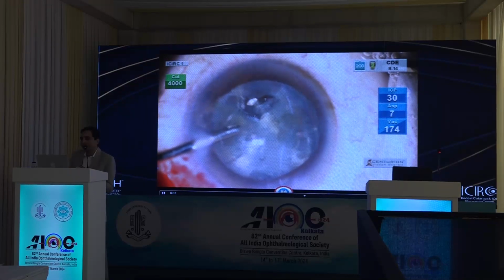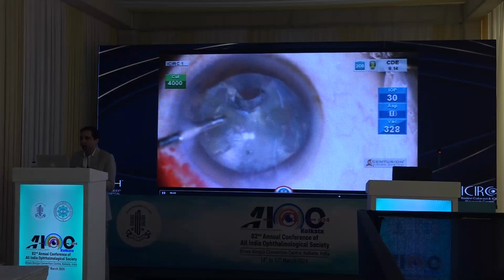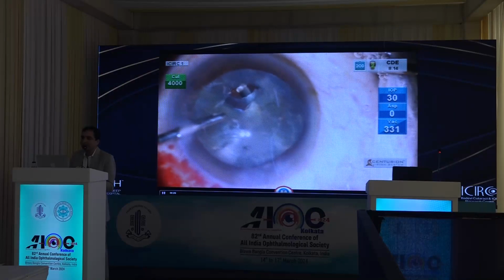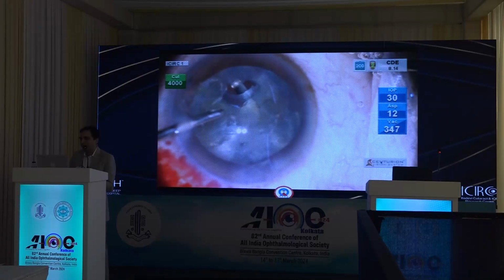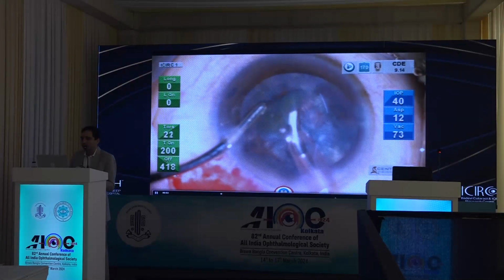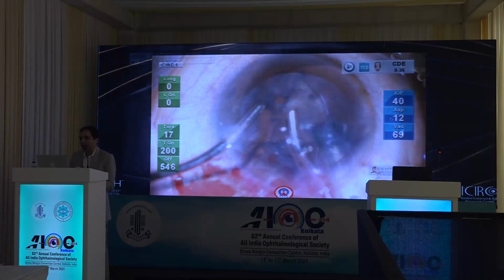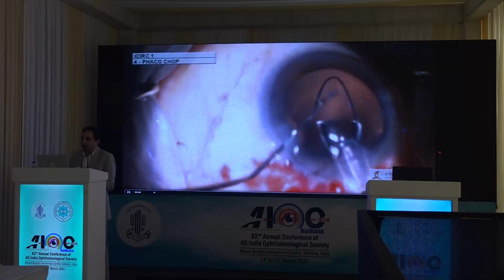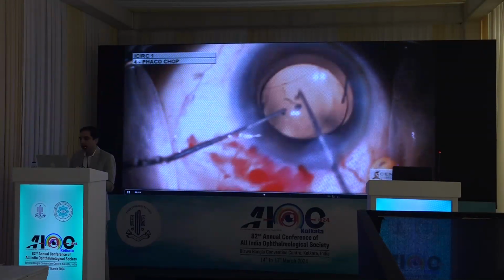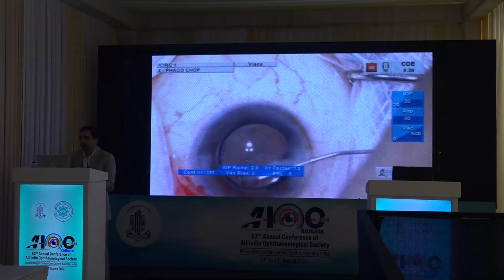That vitreous that was there, it got sucked in beautifully through this PCR that is there without causing even a millimeter of turbulence in the area of the PCR. And now since we have cut off the connection between the anterior and the posterior compartments, we can go ahead without the fear of dropping this nucleus with phacoemulsification with low parameters, low flow rate and low bottle height. Because this tear was extending up to the equator, the choice of IOL, of course, was a 3-piece IOL with optic capture. Most of these patients do very well post-operatively.